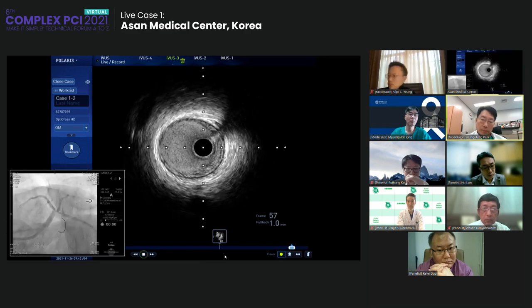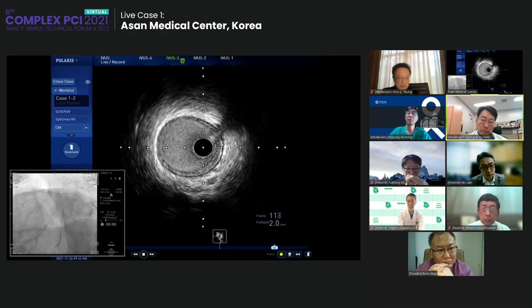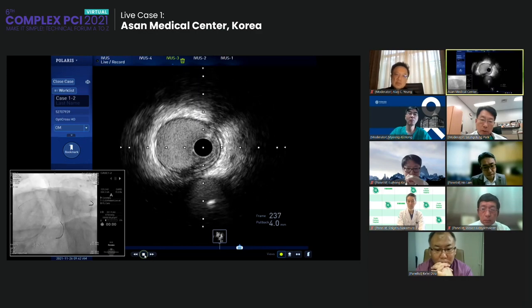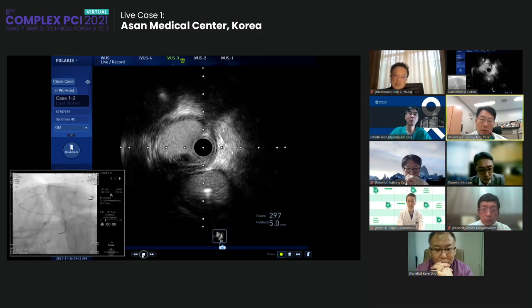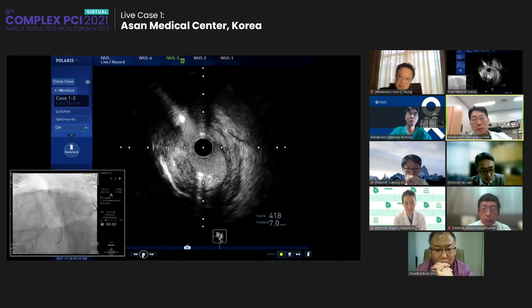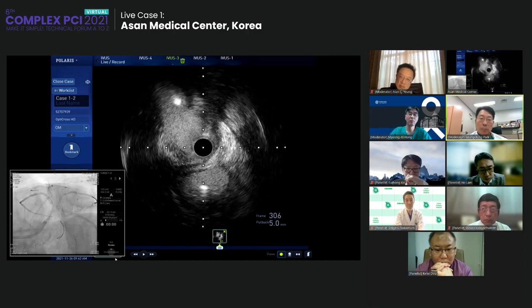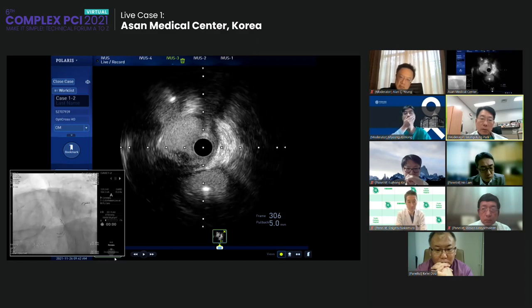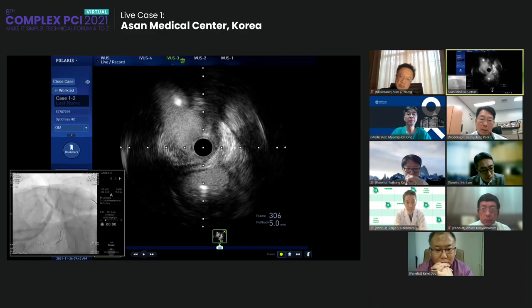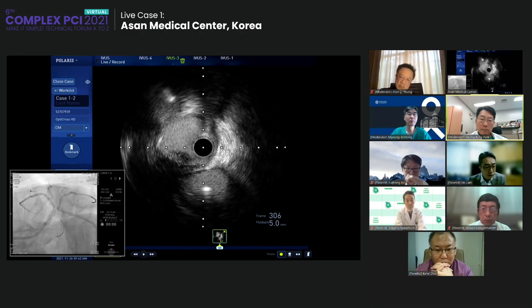Great. Proximal OM looks very fine. So I implanted... Ostium? Yeah, this is ostium. I implanted 2.5 balloons, so. Great. Perfect. Very small disease on the very ostial part of the OM branches. Yeah. However, I think it's okay. Yeah, here you can see the two wires from the LAD to the circumflex. In the middle is the OM branch.